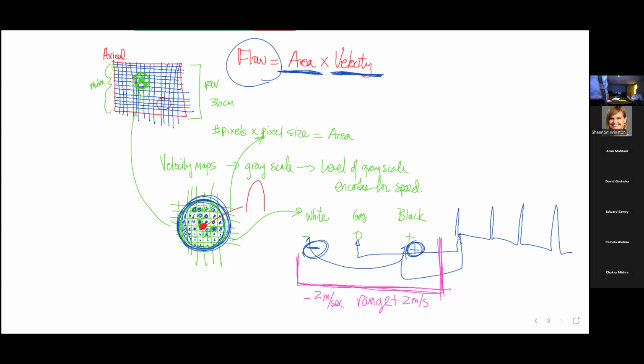Let's use an example. I've got 3 speedometers. Okay, 3 speedometers. This speedometer is, if you've got children, is on your tricycle.